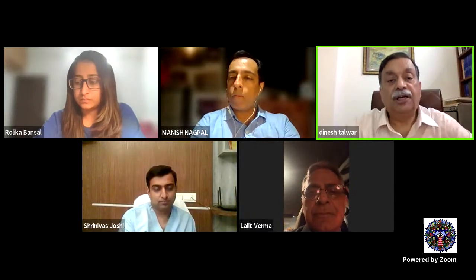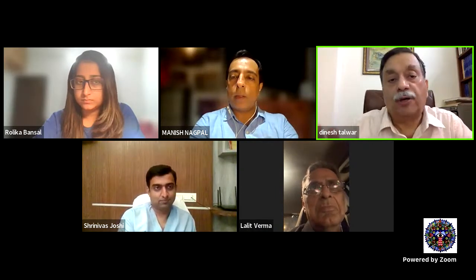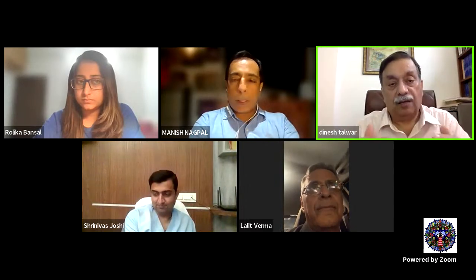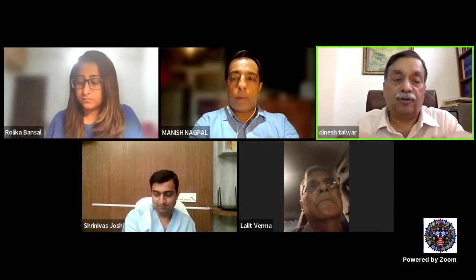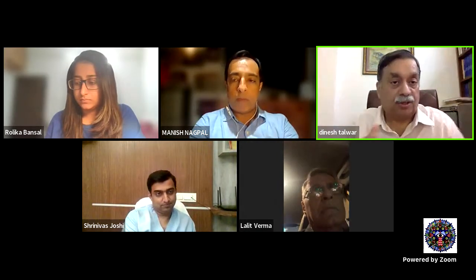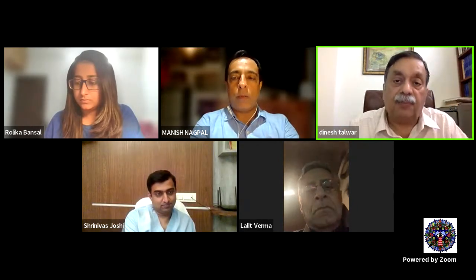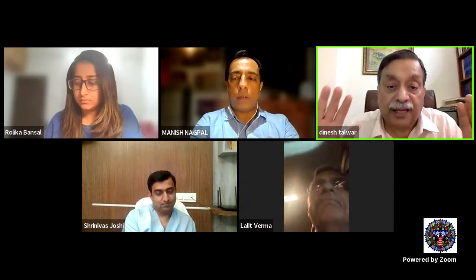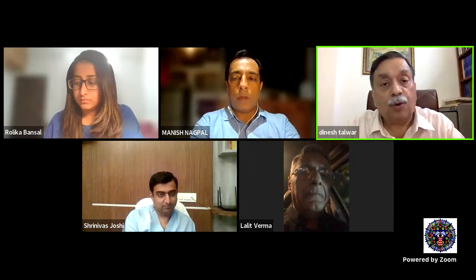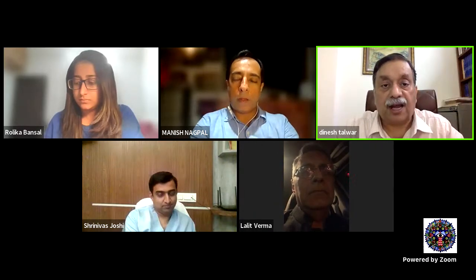Yeah, so actually, Manish, I'd like to ask you, how do you decide that now this shortening is not going to settle with any other method? For example, it's a relatively bullous RD. You remove the ERMs, and obviously the retina becomes even more bullous because the posterior part is released. And you've shown very beautifully that many membranes which we think are inoperable are actually easily operable. So that's a very good thing that you've shown. Now you've removed those membranes and you've decided you need to do a retinectomy. So how do you reach that conclusion?